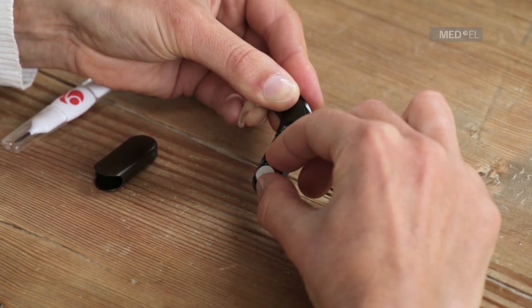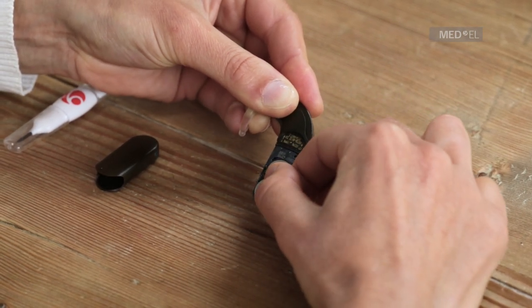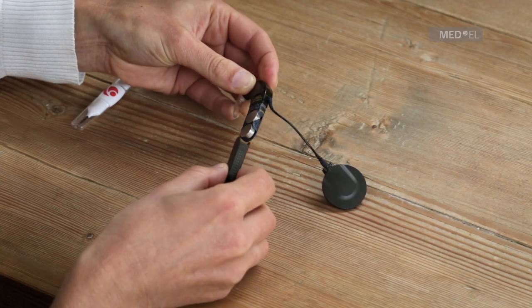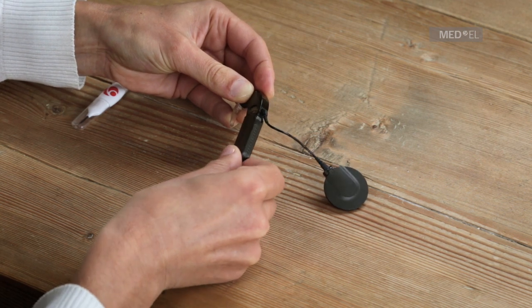The air inlets on the battery pack cover should be on the same side as the coil cable socket of the control unit. To turn on Sonnet, fully close the battery pack cover.